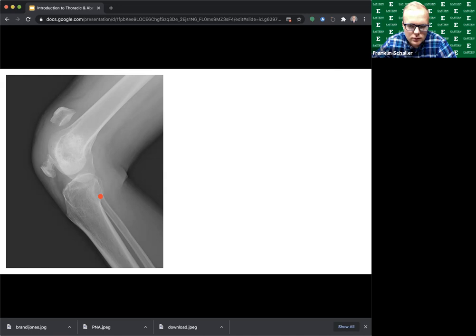Looks like she fractured that patella. I would have to agree, 100%. Miriam says fractured patella, beautiful. I would agree. It's sliced in half. It looks like she has one patella in her thigh and one in her knee. So not surprising given that hard direct impact onto the concrete and your exam as well. Nice pickup.